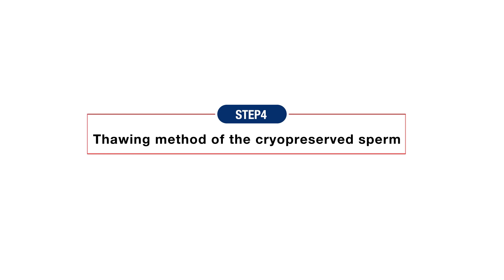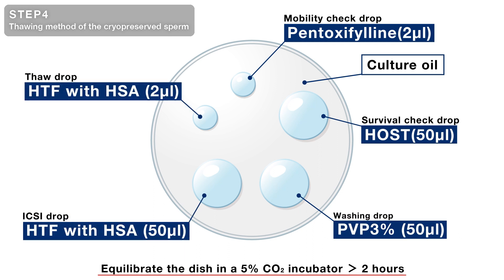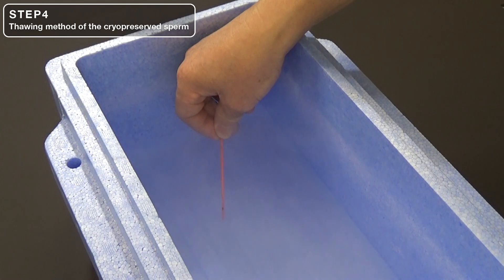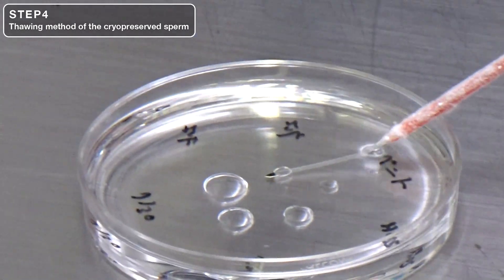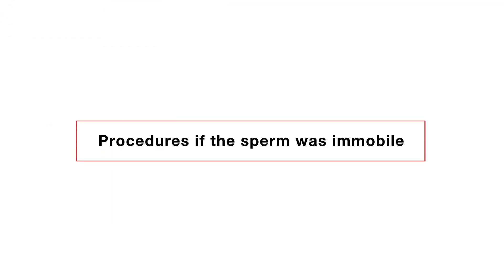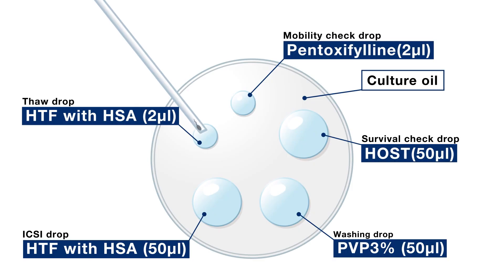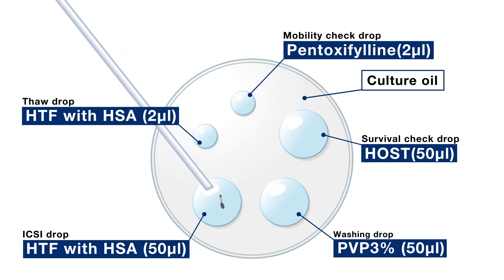Step 4: Thawing method of the cryopreserved sperm. Prepare a dish before starting sperm thaw and equilibrate it in a 5% CO2 incubator for at least 2 hours. HTF medium is used for both sperm thaw and ICSI. Take out the CryoTop from liquid nitrogen and keep it 2 seconds in air, then immerse the tip into a thawing drop warmed to 37 degrees Celsius. Check for recovered motile sperm in the drop under the microscope — motile sperm are often found at the drop rim. If immobile sperm are observed, transfer them to a pentoxifylline drop and check if they start to move. If sperm remain immobile after 1 minute, perform a HOS test to confirm viability. If sperm motility or viability is confirmed, perform the ICSI procedure according to the protocol of each facility.